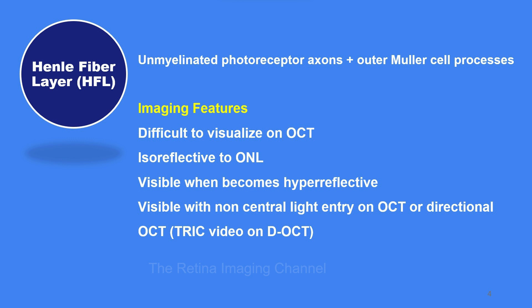This is because it is isoreflective to the outer nuclear layer, or ONL. In other words, both the Henle fiber layer (HFL) and outer nuclear layer are seen as a dark band on OCT. However, HFL may become visible when it turns hyperreflective — due to any injury like ischemia, or due to its directional property, which is utilized in directional OCT.